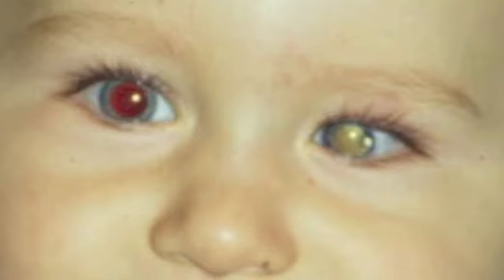Perhaps the most ominous abnormality in the red reflex is the white red reflex, also known as leukochoria. Here we see a normal red reflex in this child's right eye, but a yellow-white color in the left eye. Top on the differential diagnosis is retinoblastoma, a malignant tumor of childhood that occurs in the eye, which can be life-threatening. There are other causes of leukochoria, including infection, coloboma, and other malformations. One must always think about retinoblastoma. Urgent referral to an ophthalmologist is required.